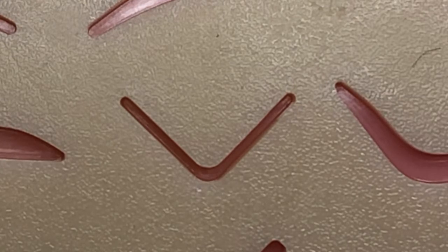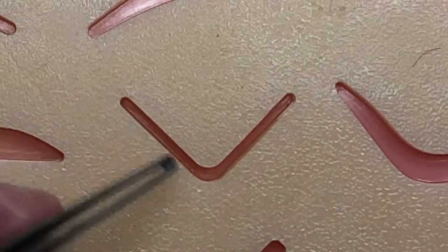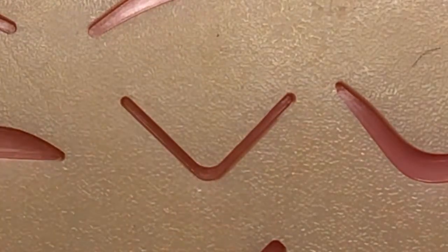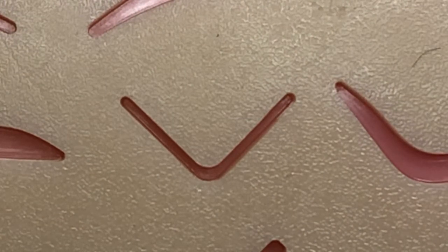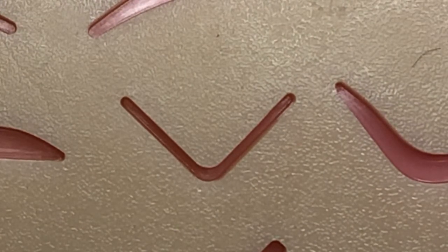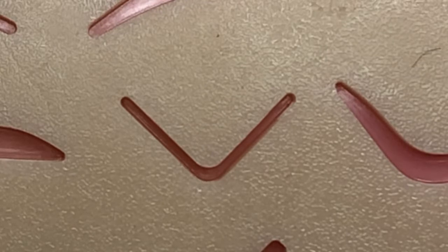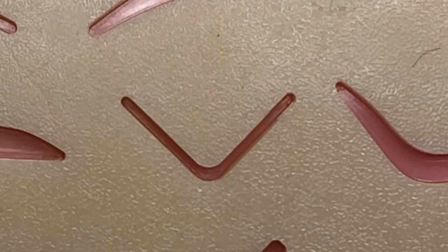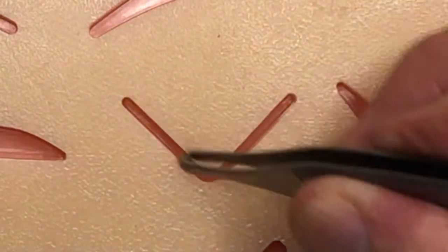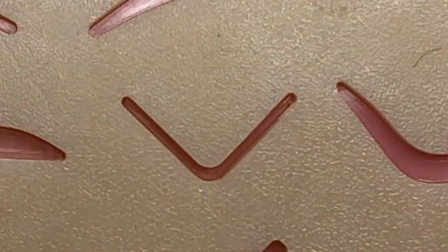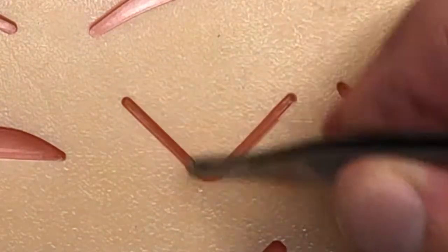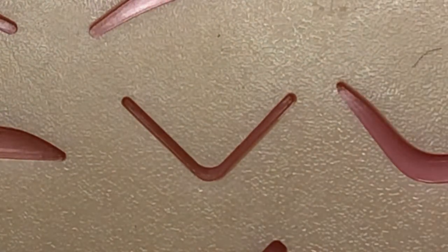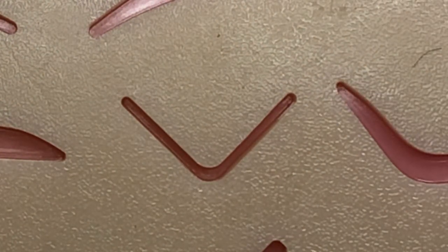So we're just going to do the V-shape. We'll talk about the Y-shape later and do that in another video. Not all wounds are created equal, and definitely all wounds are not symmetric, so you're going to be looking at asymmetry in some of these wounds that you repair. This is a nice little symmetric shape wound, everything looks nice and even on both sides.